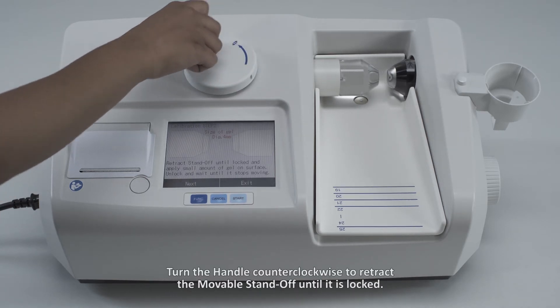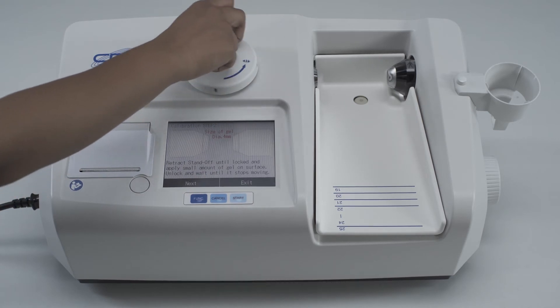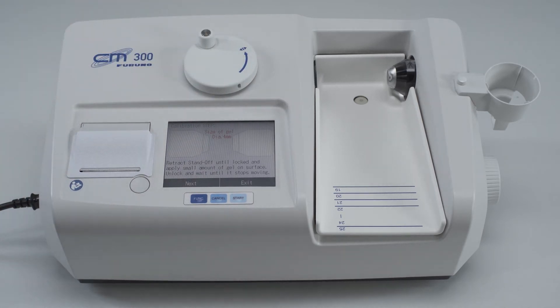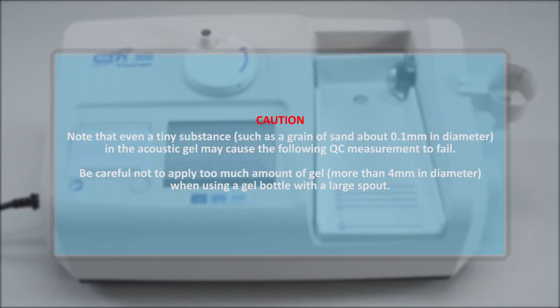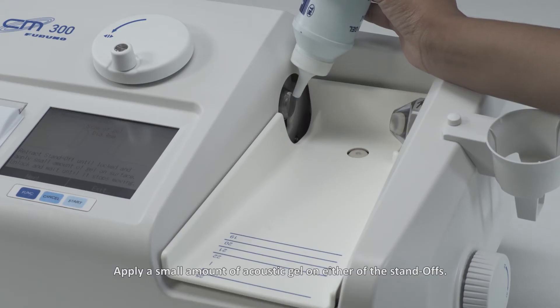Turn the handle counter-clockwise to retract the movable standoff until it is locked. Caution: even a tiny substance such as a grain of sand about 0.1 mm in diameter in the acoustic gel may cause the following QC measurement to fail. Be careful not to apply too much gel — more than 4 mm in diameter — especially when using a gel bottle with a large spout. Apply a small amount of acoustic gel on either side of the standoffs.